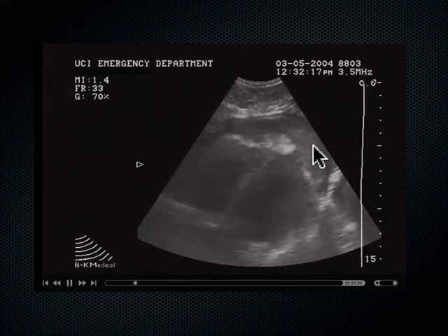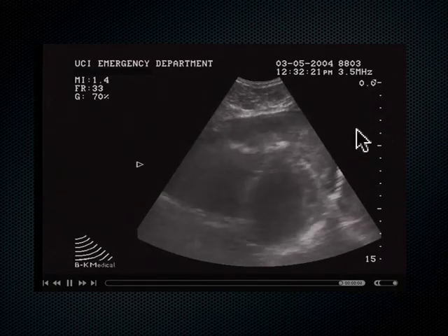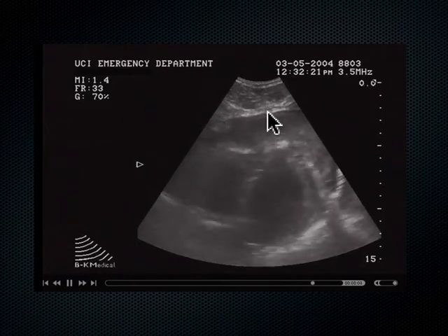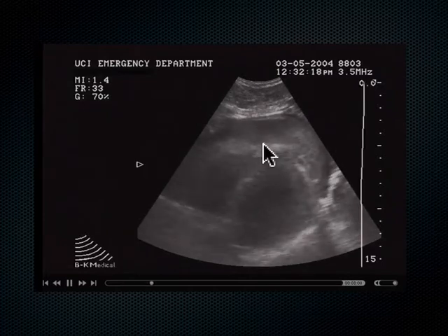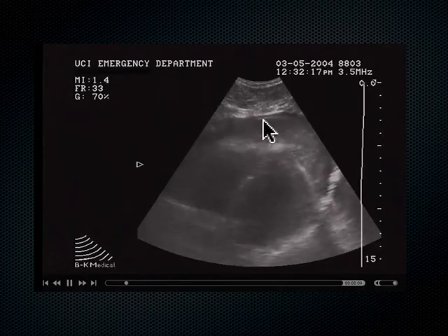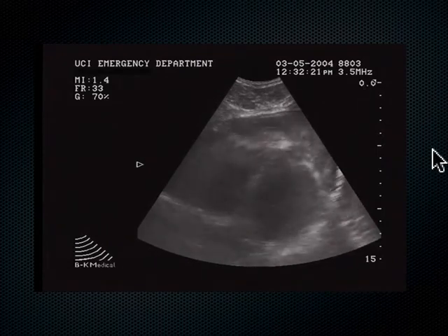I mentioned briefly that fat is usually no greater than 1 centimeter in thickness. These are centimeter hash marks. Is the distance between the myocardium and the pericardium more than 1 centimeter? Absolutely. So right off the bat, I'm very curious. Is this isoechoic or heterogenic? Fat moves with the heart. It's heterogenic. Clot is isoechoic. Looks like the liver or the thyroid. What do you think?